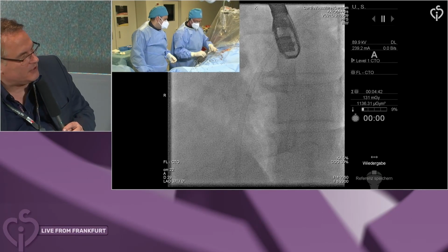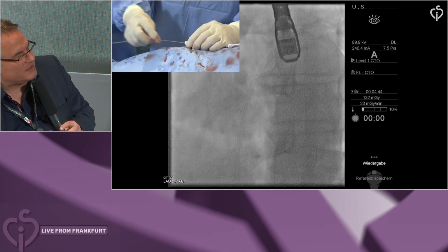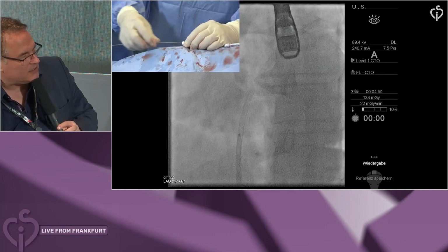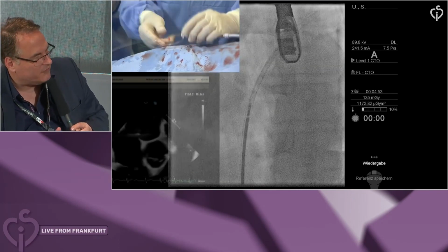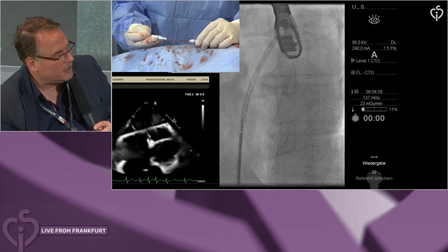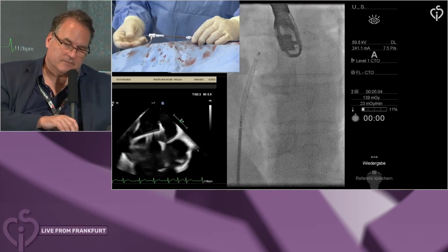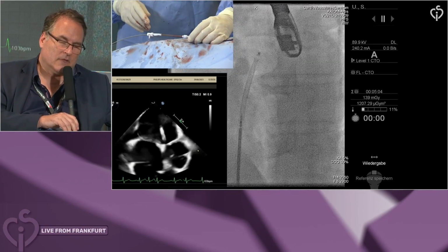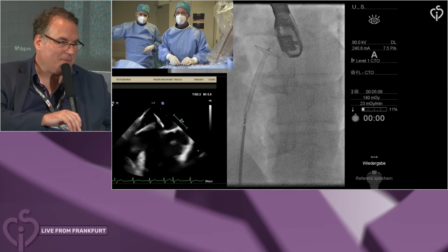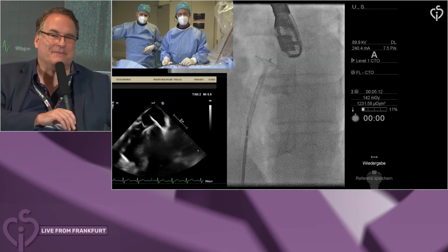We did this in more than 300 patients, published in 2009, and we did measurements of the nickel blood values in the first 48 hours after the device implant, and it drops rapidly. So it's only an issue of hours, and then it's covered, and you cannot demonstrate any nickel increases in the blood levels in patients. This has been investigated lots of times. But those who have severe nickel allergy, they don't trust your data. They say maybe it's still an issue. There were still patients concerned, I think 9 out of 300, but they had a very good outcome.